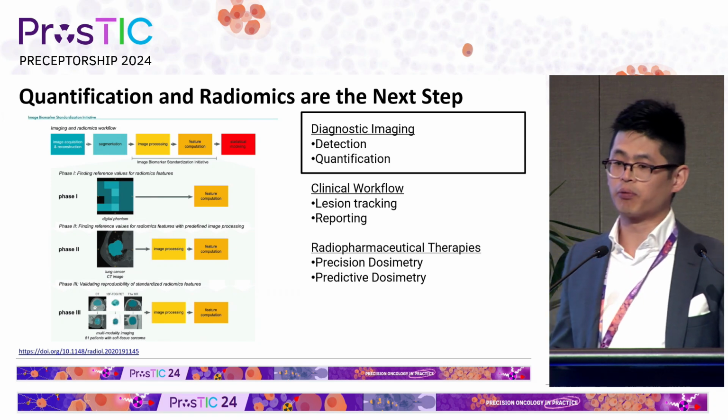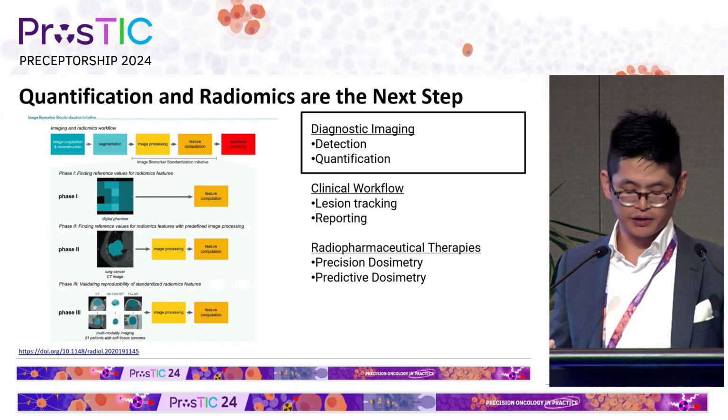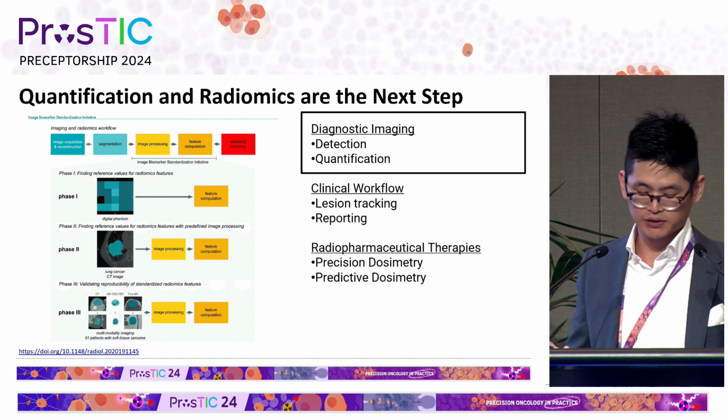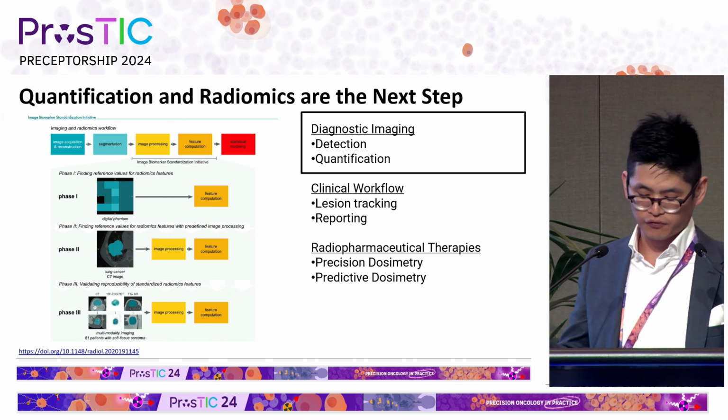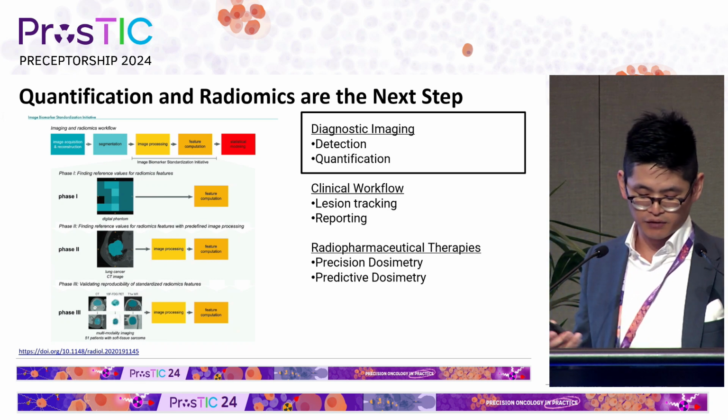Ultimately, segmentation will probably be semi-automated, and assuming segmentation has been done accurately, the next step in the AI pipeline is about quantification and radiomics. So quantification, we've heard from James about metabolic tumor volume and SUV mean. SUV mean for PSMA over 10 has been associated with better outcomes.